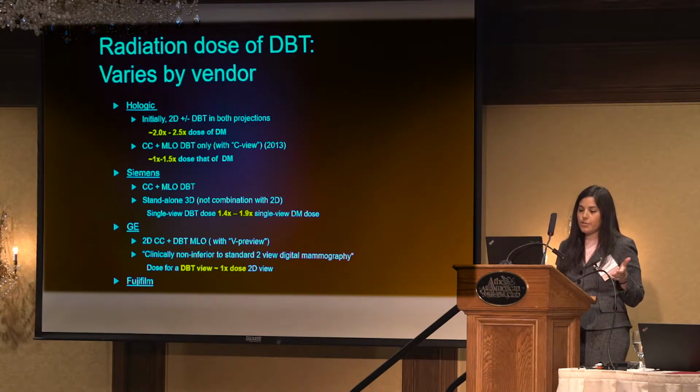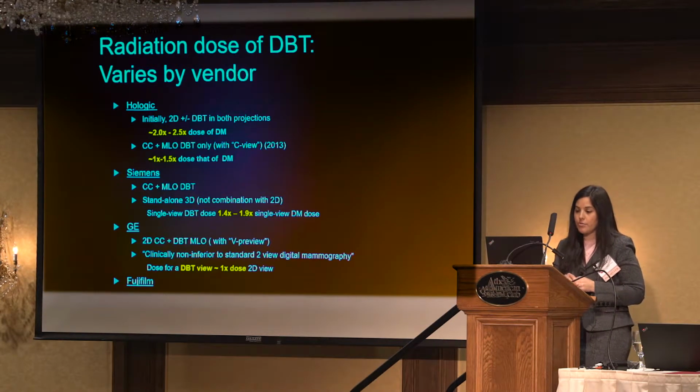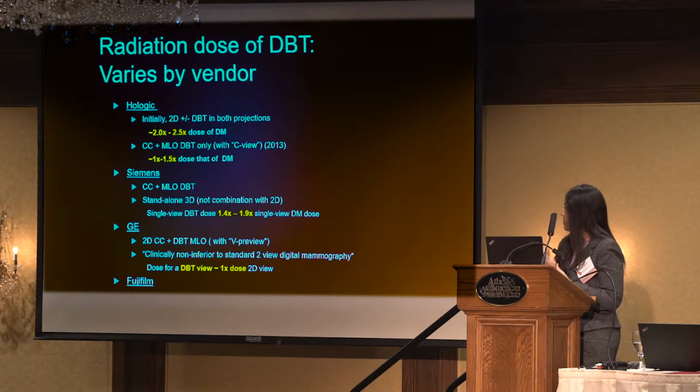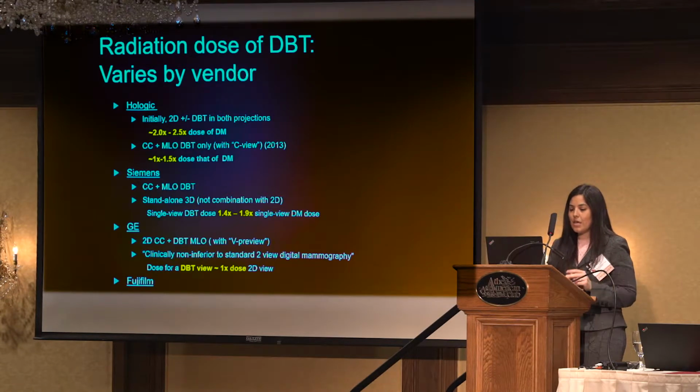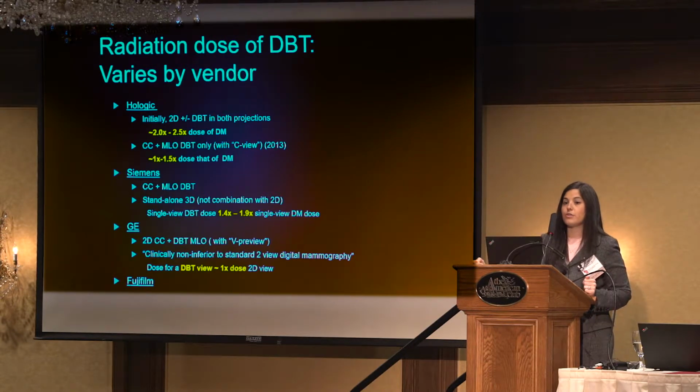Siemens is also FDA approved for a standalone 3D acquisition. They do not require the 2D exposure, and their single view DBT dose is quoted at 1.4 to 1.9 times that of a single diagnostic digital mammography dose. GE is actually FDA approved for a 2D CC with a DBT MLO with a V-Preview, which is their synthetic mammogram. Their FDA approval says clinically not inferior to standard 2-view digital mammography. They did not show superiority.